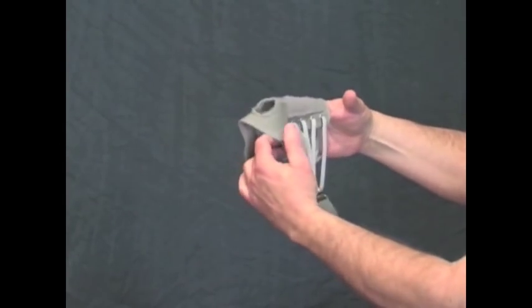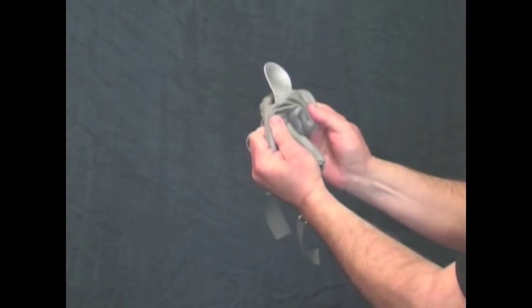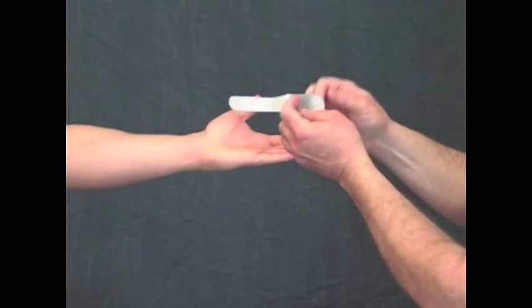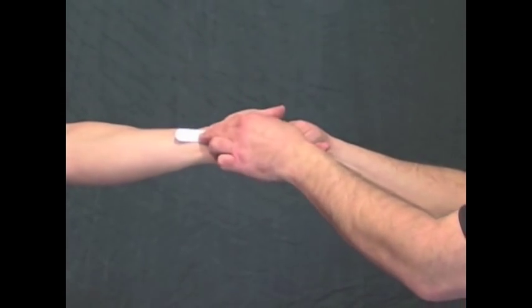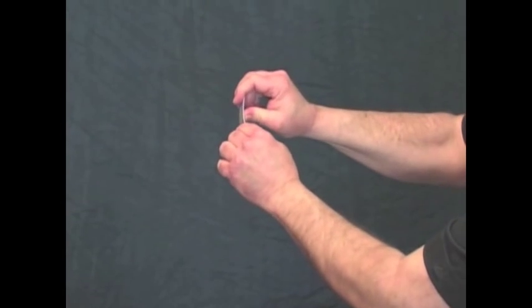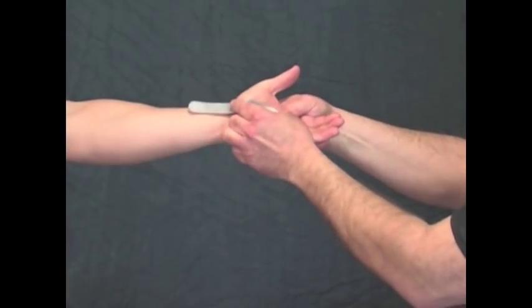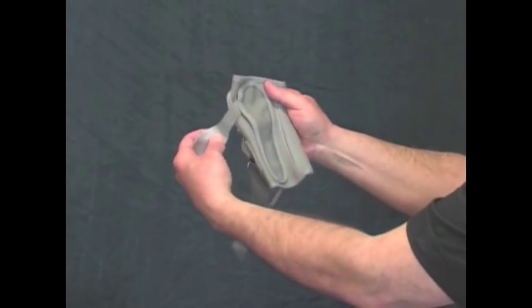Next, remove the metal splint from its casing. This is done to ensure that the splint is properly contoured to the patient's palm and lower arm when the wrist is in a neutral position. Note that the spoon-like shape of this particular splint provides a more comfortable and intimate fit for more effective support. With the patient's wrist in a neutral position, shape the splint if necessary to match the palmar surface of the hand and wrist. Reinsert the metal splint into the casing.